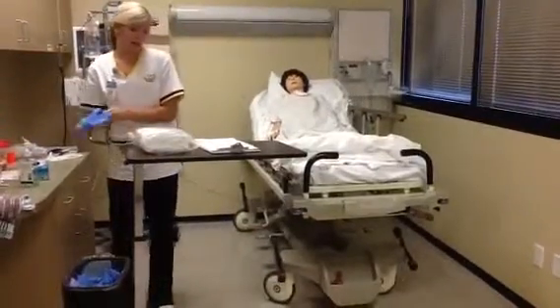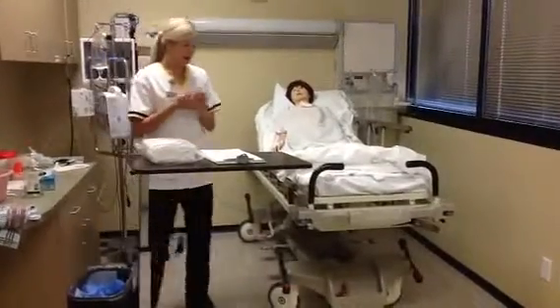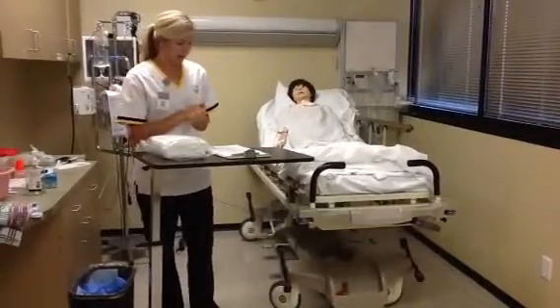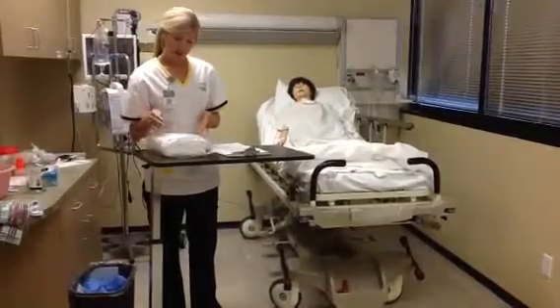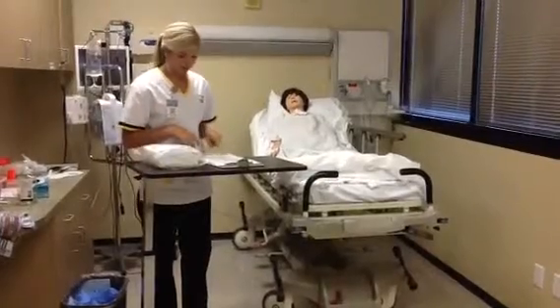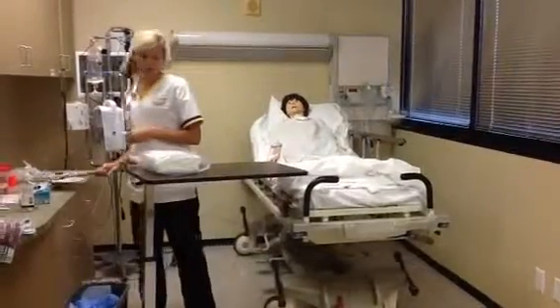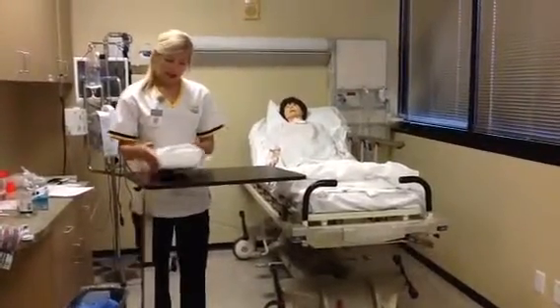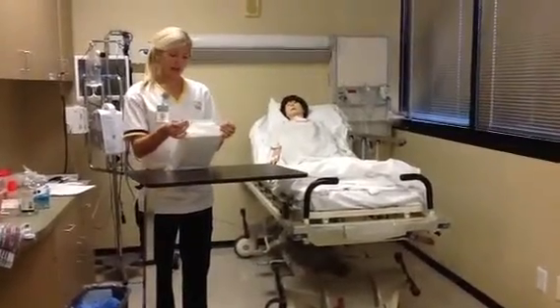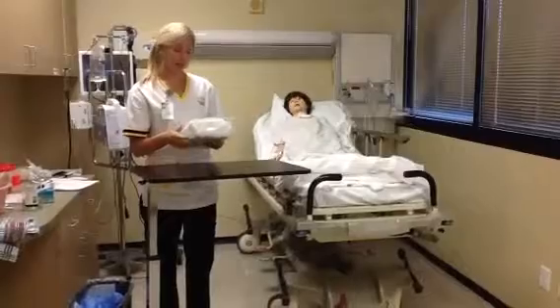So I'm going to come out, take my gloves off, perform hand hygiene again. Now I'm going to check my catheter with the provider's orders. I want to verify that what I have here is a 14 French catheter, which does match up with the order. I also want to make sure that what Mrs. Knight is allergic to is not in the catheter, which it's not. So now I'm done with my provider's orders. I'm also going to make sure that this catheter is not expired, which it's not, and I would want to check that the catheter is closed and intact, which this one has been used for practice, so it's not, but in a real life scenario, I'd make sure that it was intact.